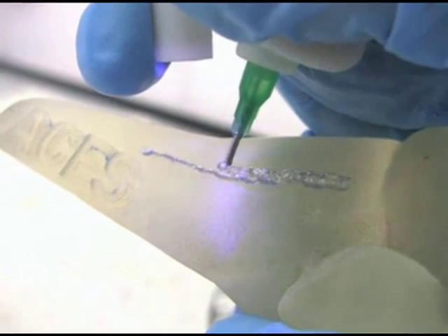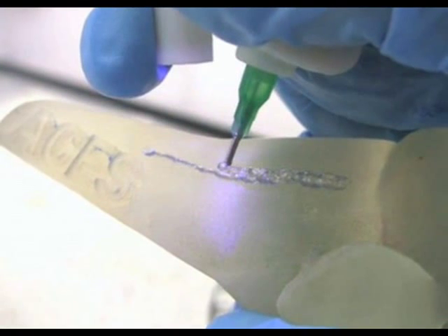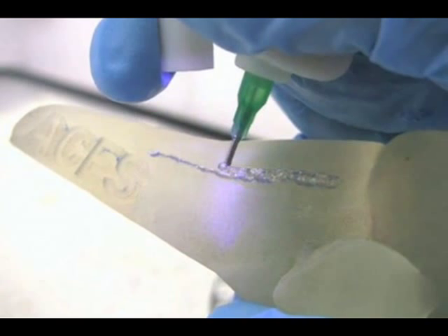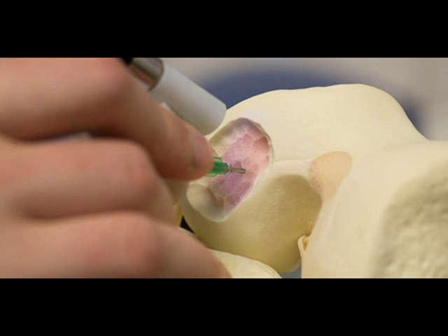The BioPen works similarly to 3D printing methods by delivering cell material inside a biopolymer such as alginate, a seaweed extract, protected by a second outer layer of gel material.